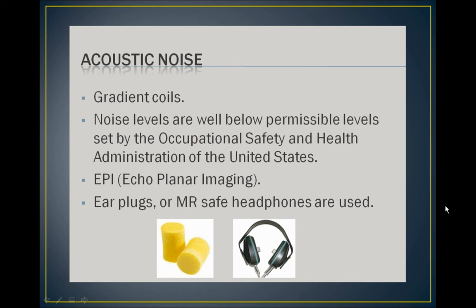The magnetic field gradients that rapidly switch on and off are the primary source of noise in the scanner. The loud tapping or knocking noise may scare the patient and create problems communicating with the patients, and even cause temporary hearing loss. EPI, or echo-planar, imaging techniques require more rapid gradient switching and have higher noise levels, but are still below permissible levels set by the Occupational Safety and Health Administration. EPI sequences tend to be very short in duration, and the shorter time exposure to the louder noise may actually be less of a problem.